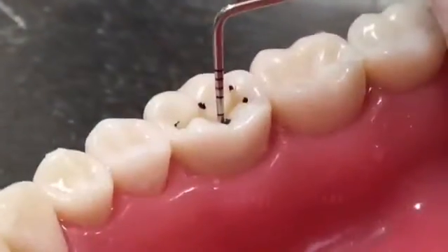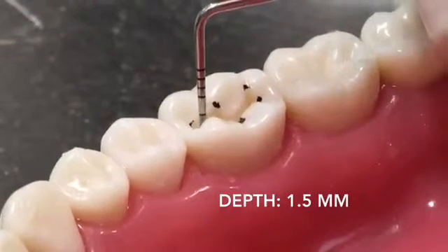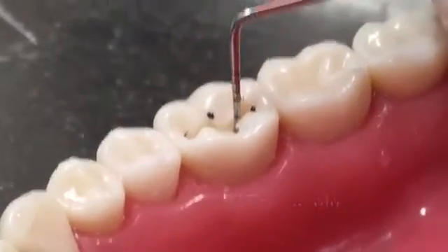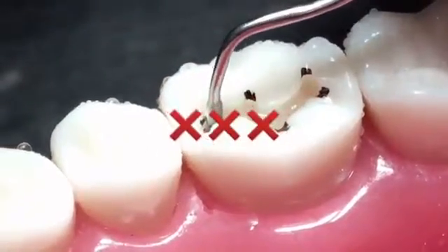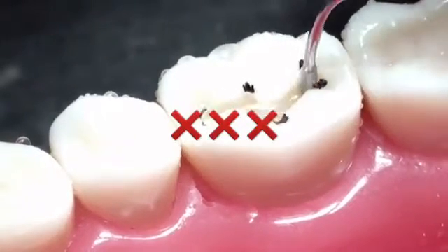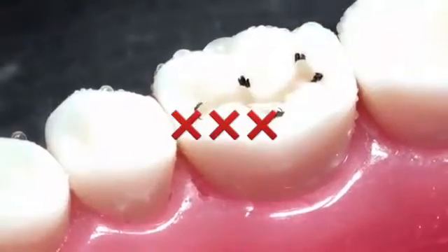The depth of the cavity should be from 1.5 to 2 millimeters to be able to resist fracture. As for the width of the cavity, the smallest condenser should be able to fit in without getting stuck. If it does get stuck, you're going to have to widen the cavity.